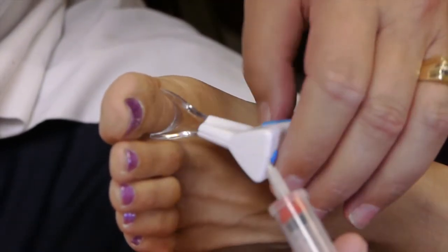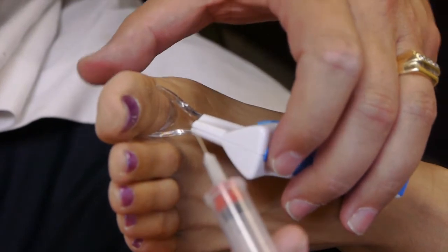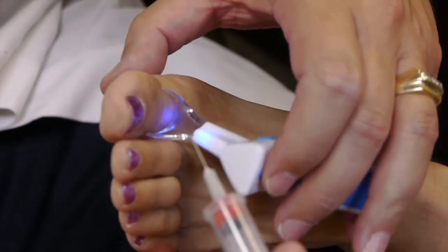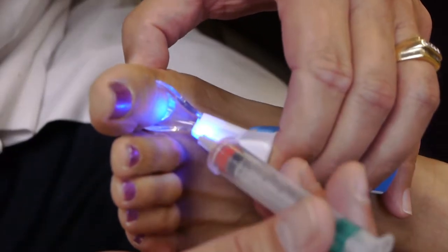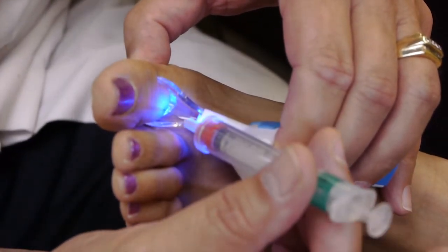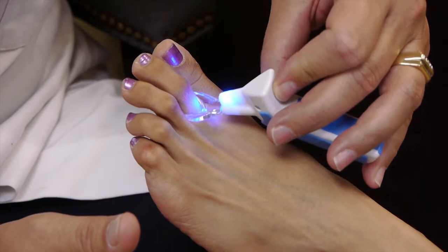When I do this side over here, which is actually the medial branch of the dorsal, or the medial branch of the deep peroneal, I use my thumb and I actually use that as resistance on this side, so I can actually push a little bit harder, and then I can put this right where I want it to go, just like that. Okay.